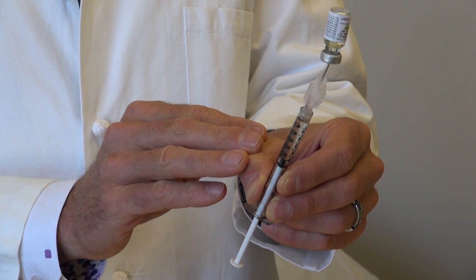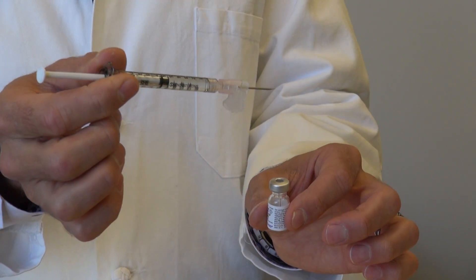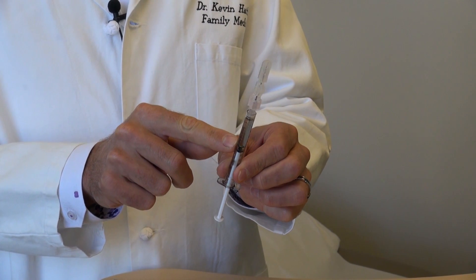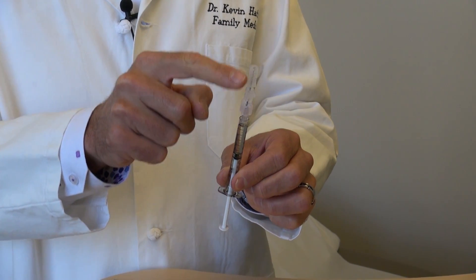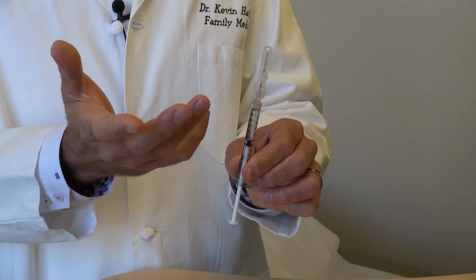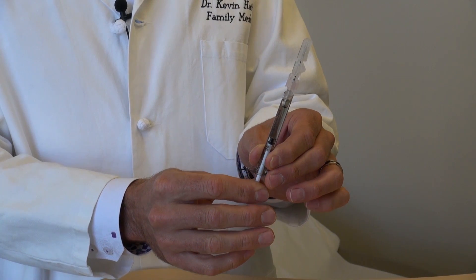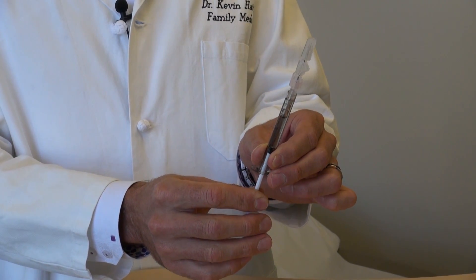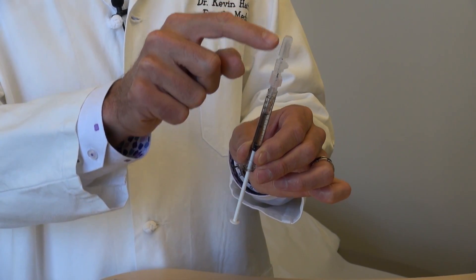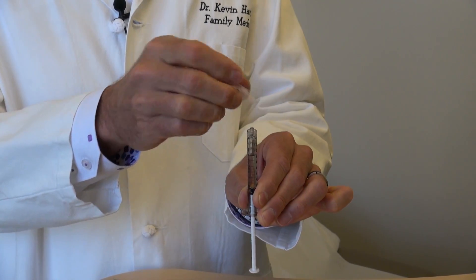Turn the syringe over and remove it from the bottle. Before taking the needle off, remember there's medicine inside the metal shaft and hub — you don't want to waste that. Back down on the plunger to about 0.7 or 0.8, drawing about three-tenths of a milliliter of air to pull all the medicine down into the syringe, and then you can remove that needle.